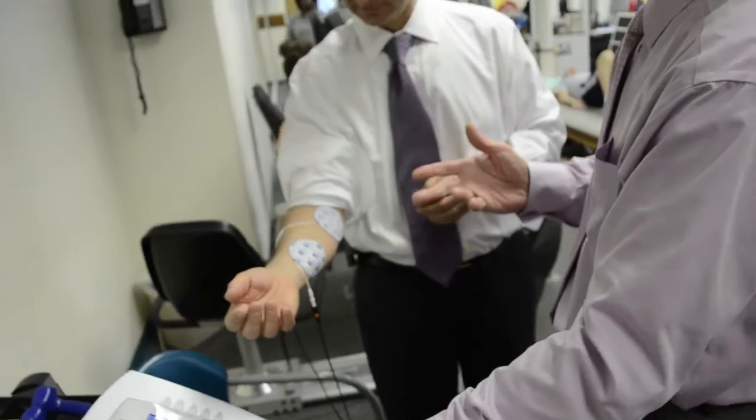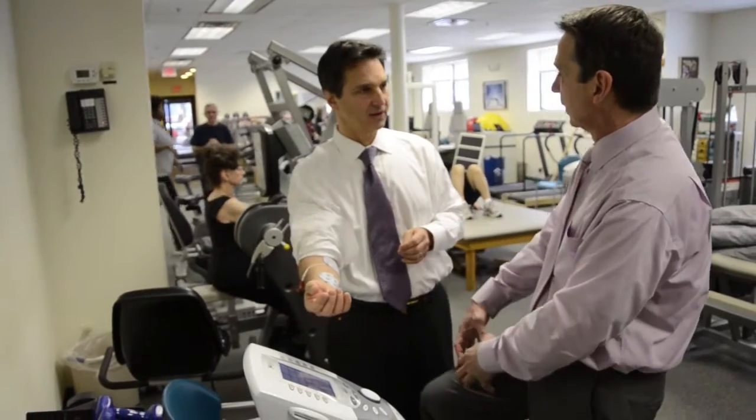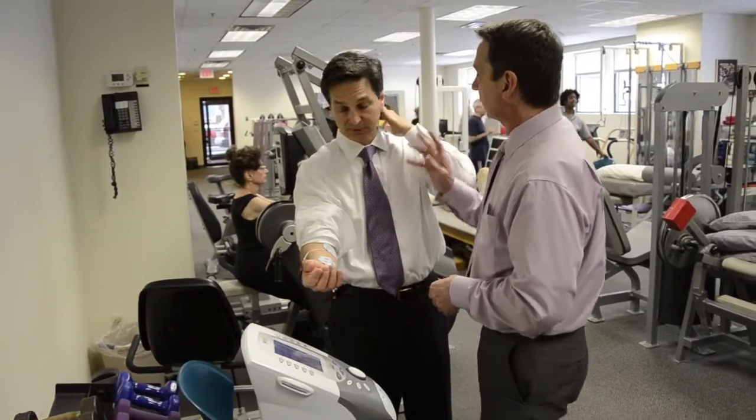We can do this for pain relief, but we can also use this for muscle re-education. Like after knee surgery, we put this on the quadriceps and crank it up in a tetanizing contraction to help stimulate. But people with cervical herniated disc are going to show up in spasms.